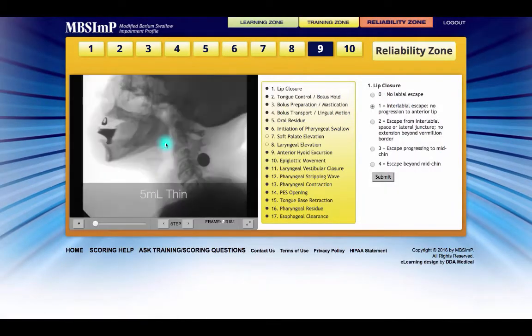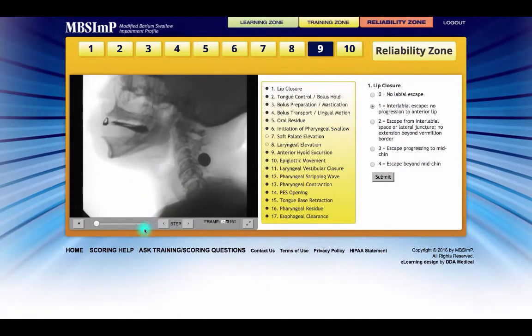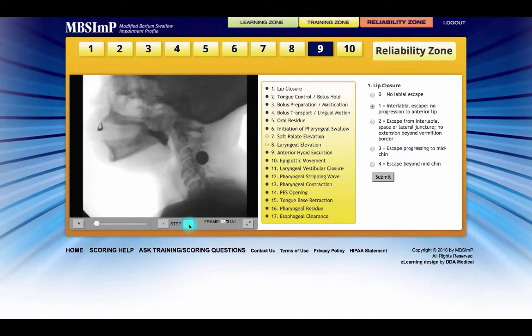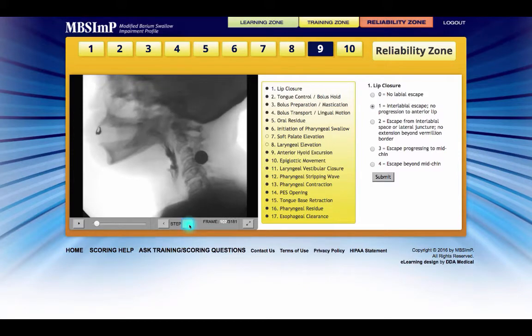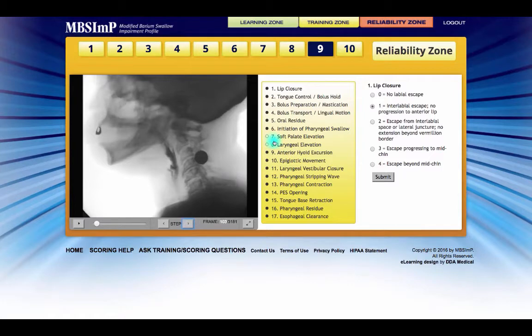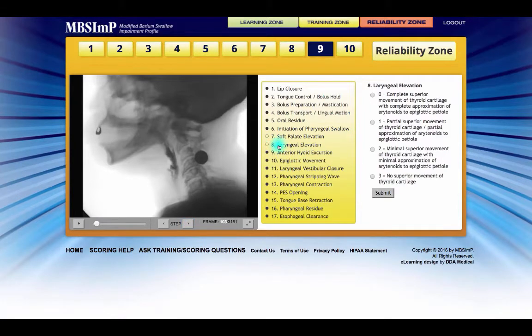For the most part, working with the studies in the reliability zone is the same as in the training zone. There are a few differences, however. After selecting and submitting a component's score, no immediate feedback is presented. There are no green checks or red Xs marking the correctness of submitted scores. Darkened circles do, however, denote that a component has been scored. In the training zone, once a component's score is chosen, it must be submitted.